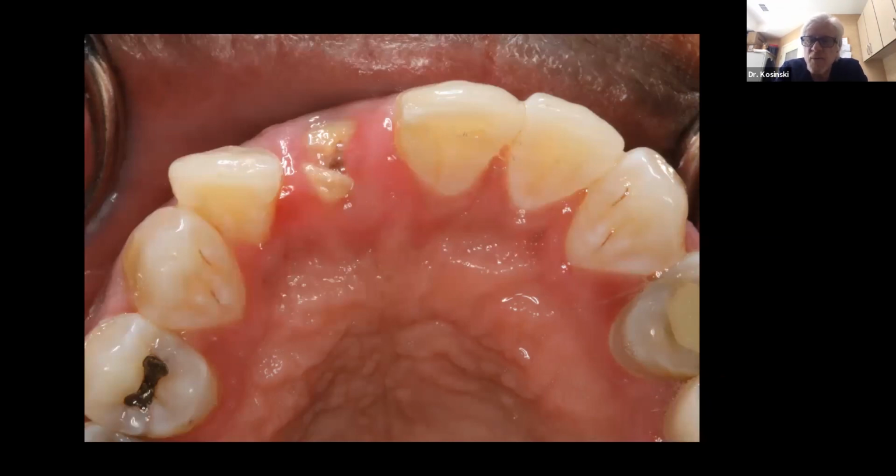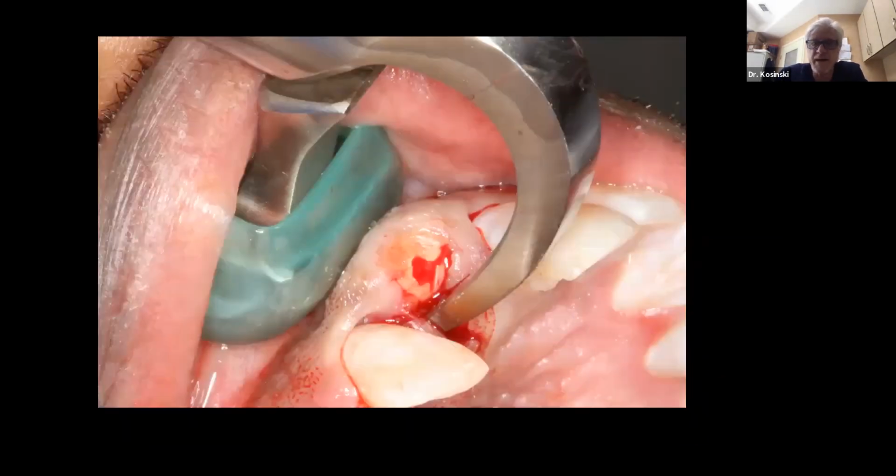It's very, very important to maximize aesthetics, to try to remove this tooth as atraumatically as possible and maintain as much of the hard tissue as possible. Many of you have seen some of my videos or webinars on the use of the Golden Dent physics forceps. This is an instrument I would not work without. I'm not going to talk too much about it, but it is simply a very specialized instrument. It's really not a forceps. It's more of a luxator.